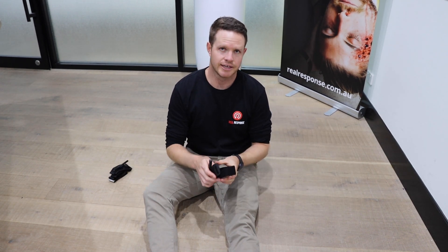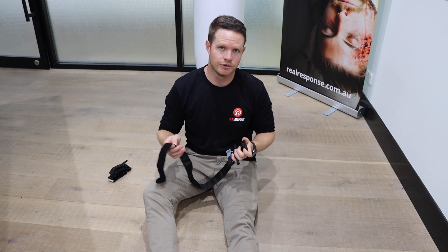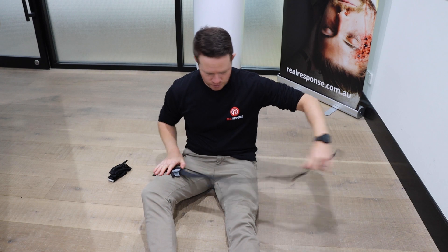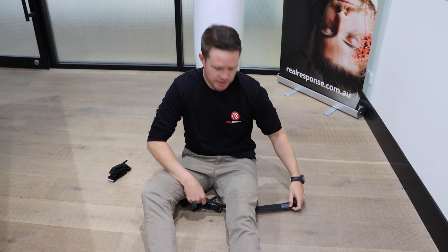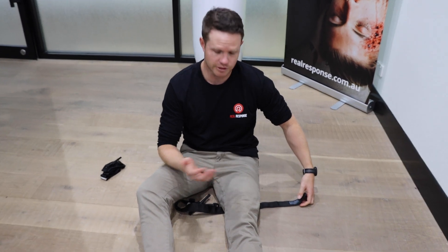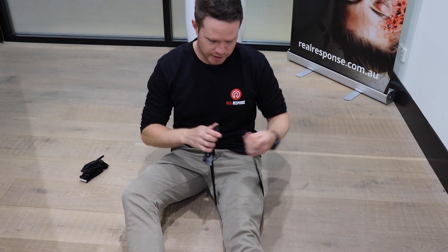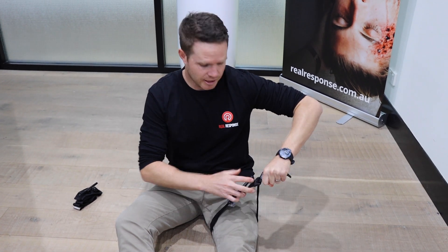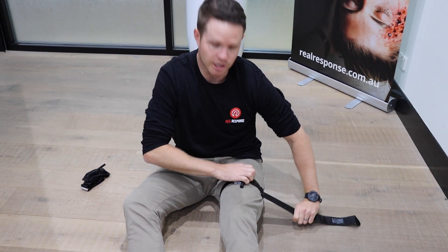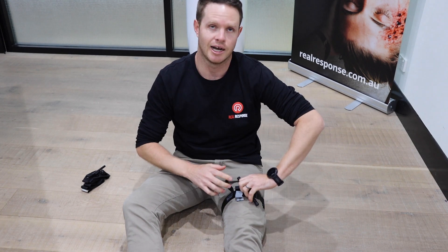Depending on the injuries, it may be quicker to pull everything apart and feed it through. Pull it apart, place the pressure bar facing upwards on the good side, then feed the tail underneath the injured leg - high and tight depending on the situation, or two to three inches above the wound. Once fed through, feed it through the buckle, grab that tail and the pressure bar, and pull it down making sure you've got an indent in the skin. Then loop it around, keep pressure, put the velcro on itself, and start to twist the windlass.